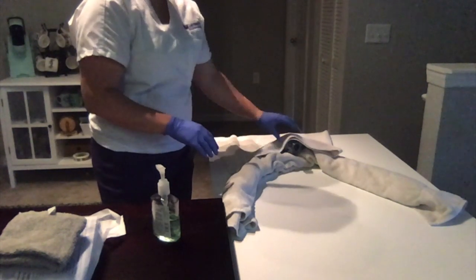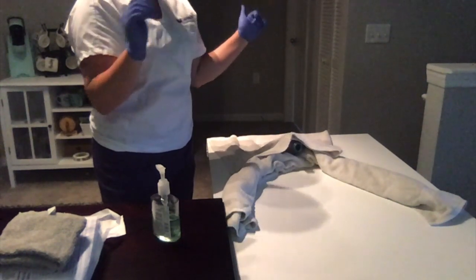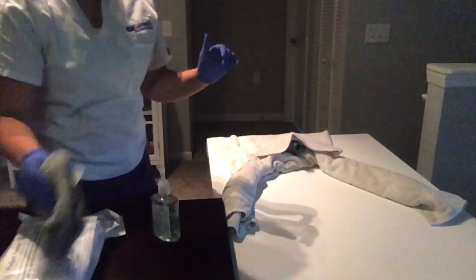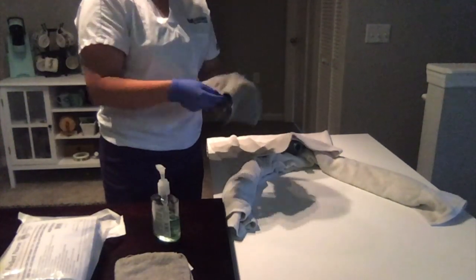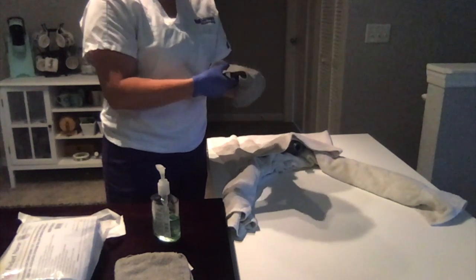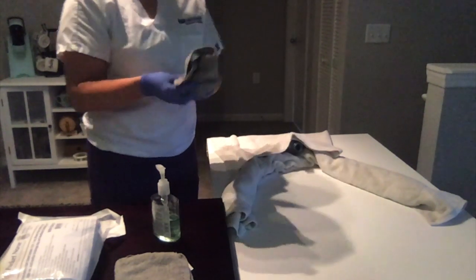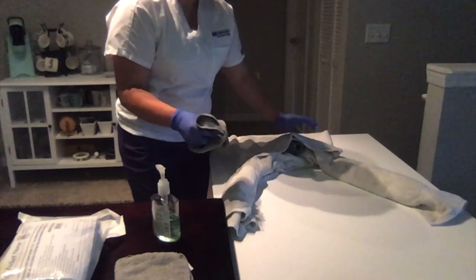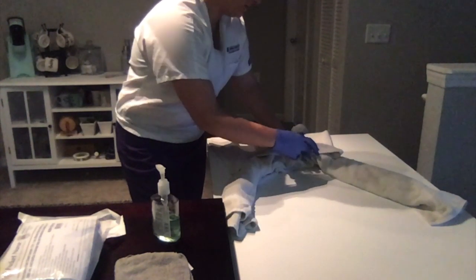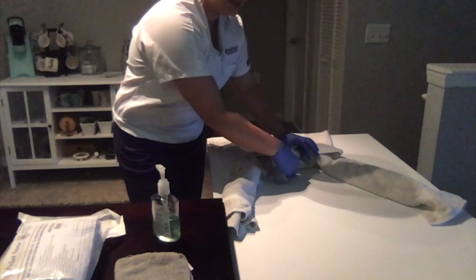Once I've done that, I'm going to make sure that I have adequate lighting, and then I'm going to go ahead with pericare. So I'm going to go ahead and put this on. I'm going to spread the labia. I'm going to go ahead and go around and down.